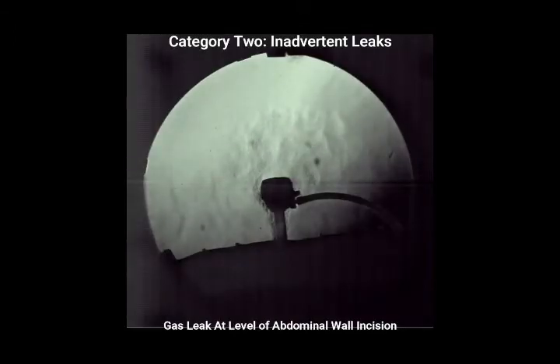Leaks can also though occur inadvertently via the trocar incision, either because the wound has been made fractionally too big or stretches during the case due to instrument and trocar movements.